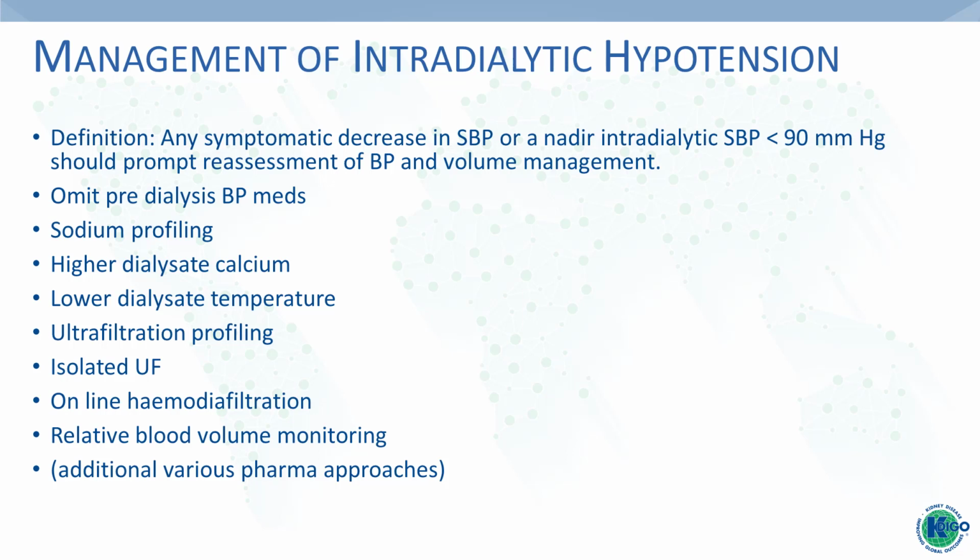So there are a few things that we can do. I think people omit pre-dialysis blood pressure medications, and some of the modifications on dialysis that we do include both sodium profiling and ultrafiltration profiling. To do that often requires the biofeedback with relative blood volume monitoring that occurs in our more modern machines.